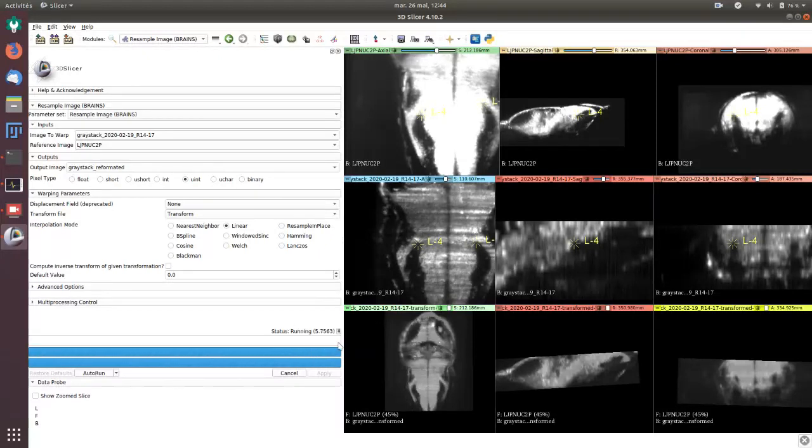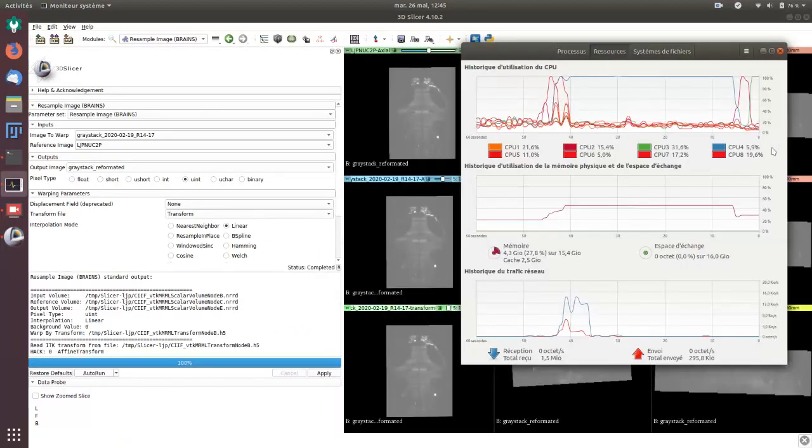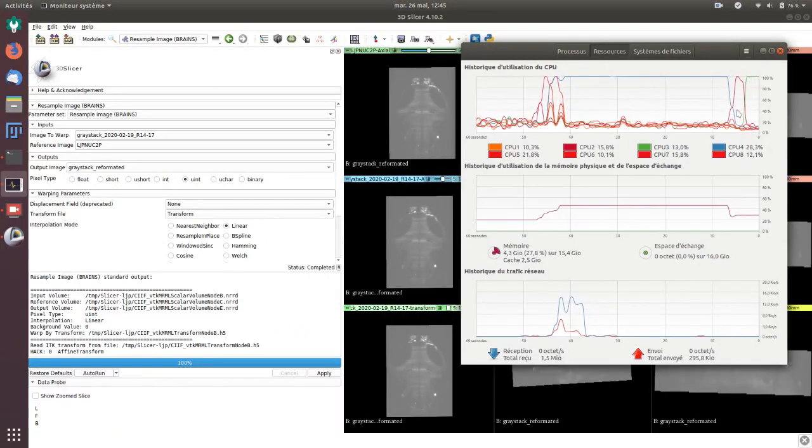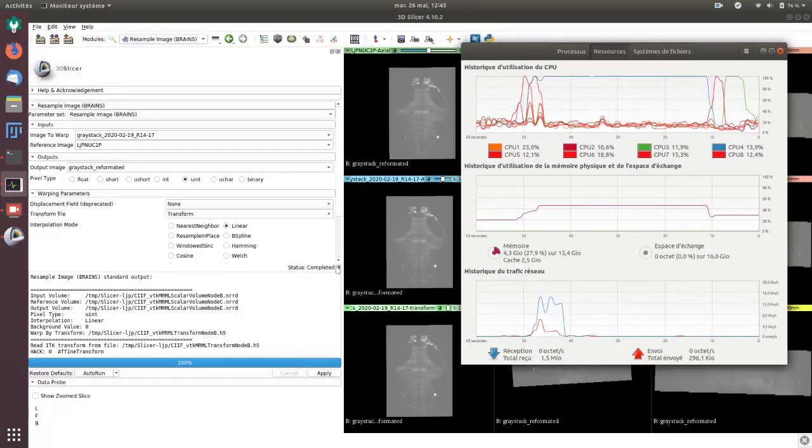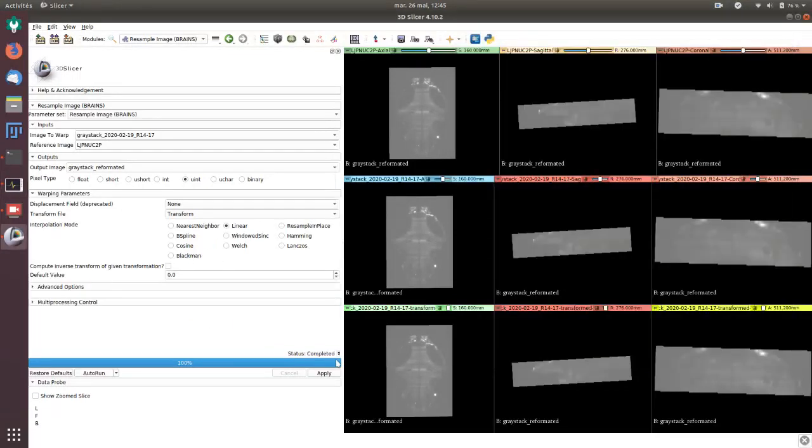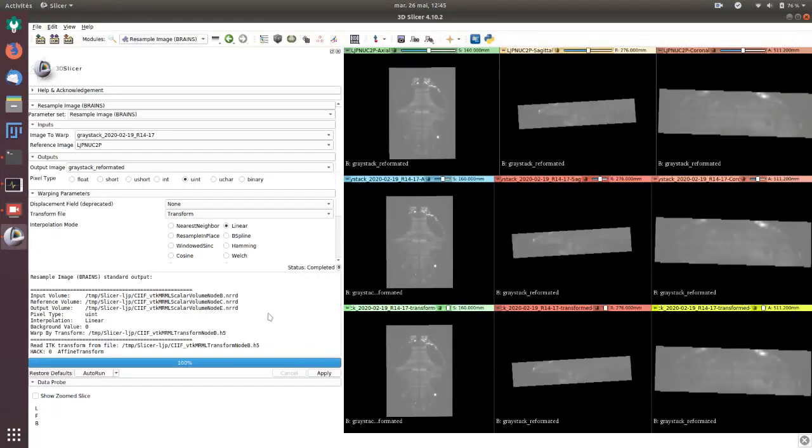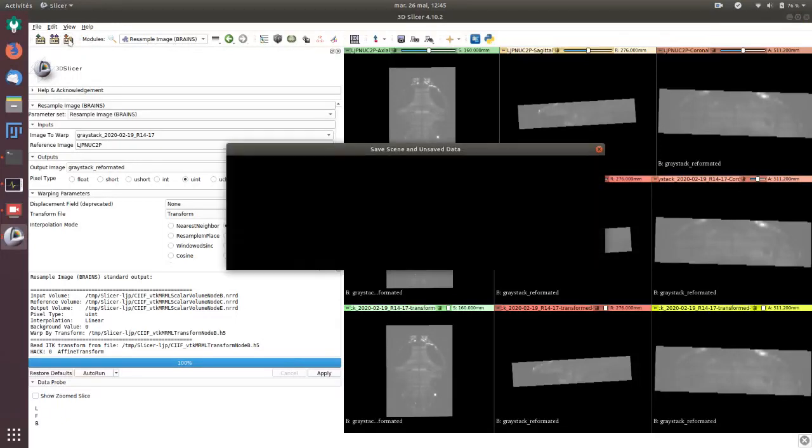Okay, so now it's finished. You can see it was a bit longer than expected but it's finished. To export this you have to click save.